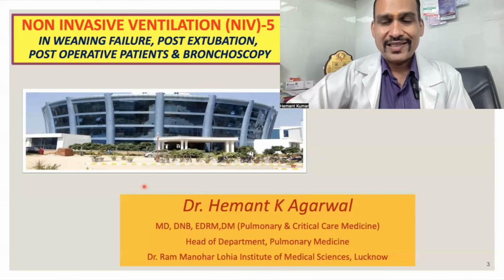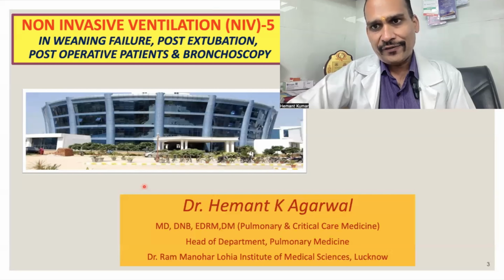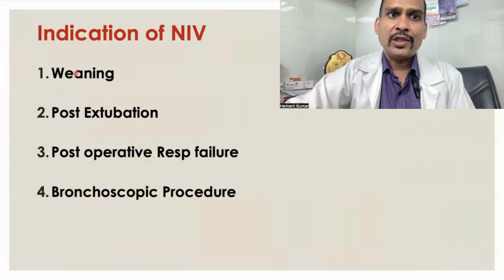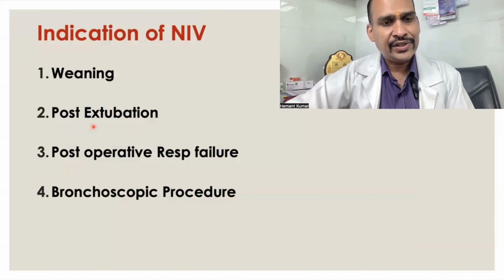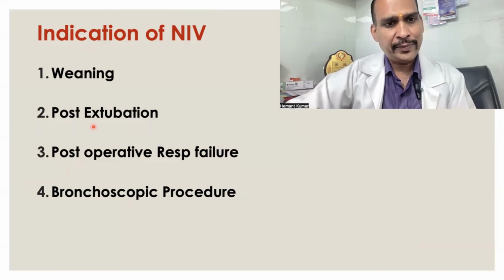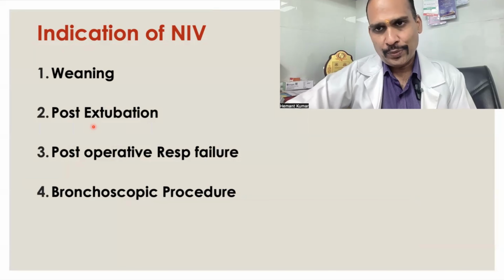Hello friends, in this series on non-invasive ventilation, we will discuss part 5. In this part, we will discuss the role of NIV in weaning failure, the role of NIV post-extubation from invasive mechanical ventilation, the role of NIV in post-operative or pre-operative patients, and the role of NIV while doing bronchoscopy.